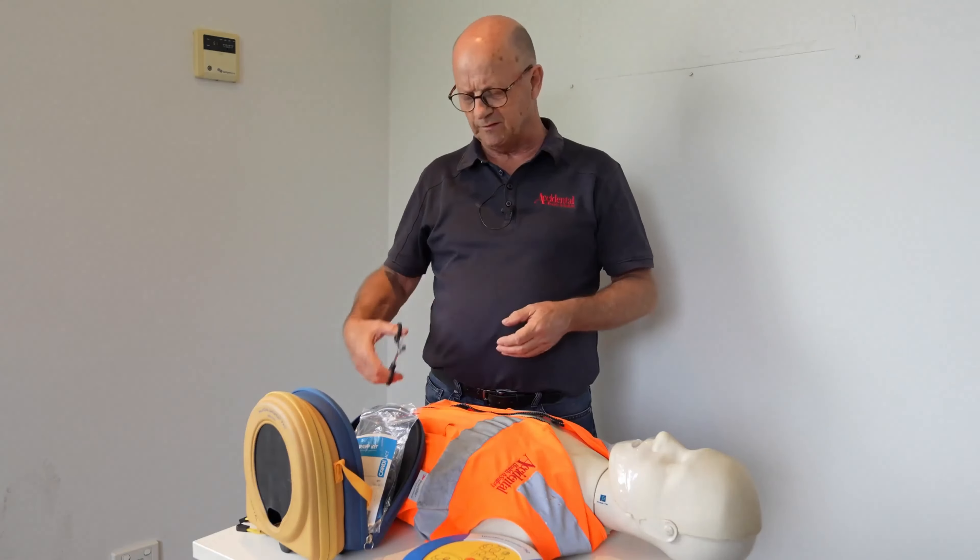Now we have the electrodes or pads exposed, and as you can see there are pictures showing the actual placement. Apply pads to the patient's bare chest as shown in the picture, pressing pads firmly to the patient's bare skin. This one goes on the left side as shown in the picture, and this one on the top right side.